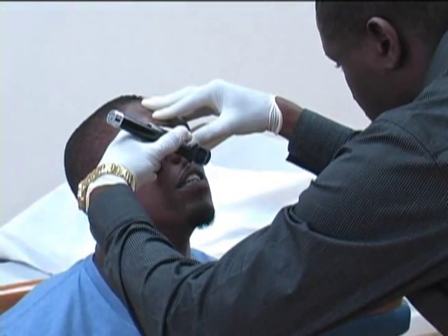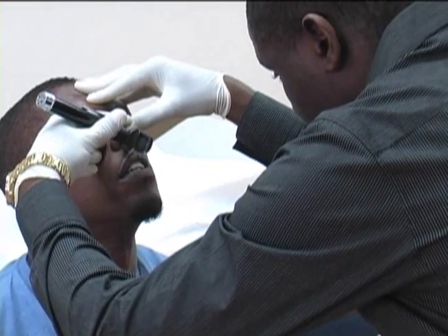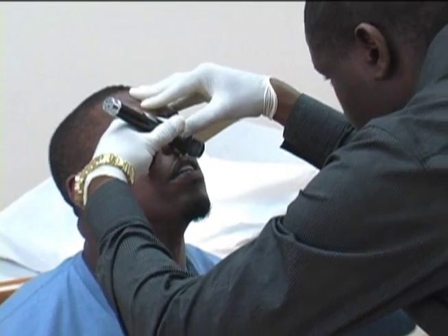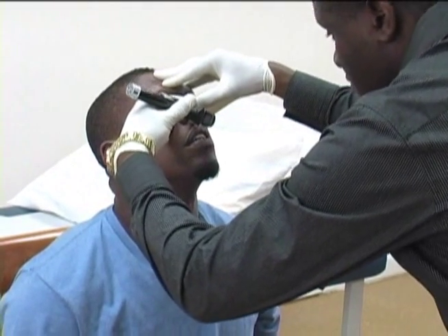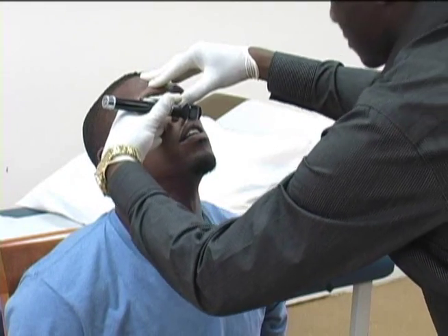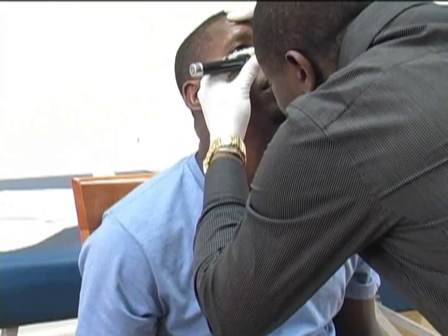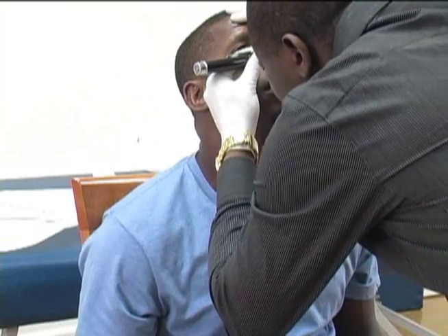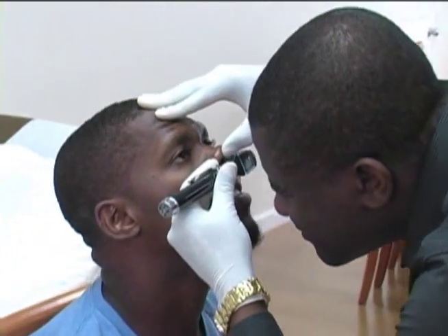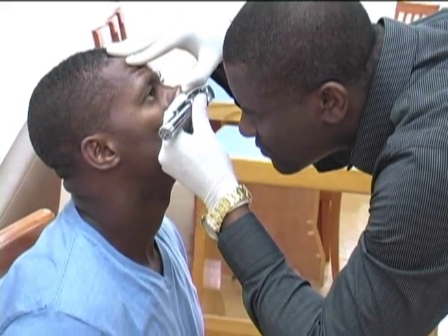The axis of the anterior nares is upward and backwards, and that of the posterior nares is backwards. Have the patient tilt the head slightly backwards. Tip the patient's chin up or elevate the tip of the nose. The speculum is introduced in an upward and backward direction under direct visualization. Avoid touching the nasal septum. The floor, lateral, and medial walls are systematically examined. Each nasal cavity is examined in the same manner. The normal nasal mucosa is reddish, moist, and slippery, without retention of secretions in the floor of the nose or in the area of the nasal meatus.